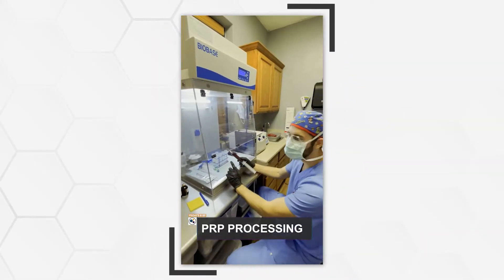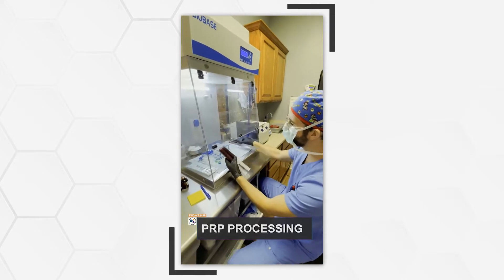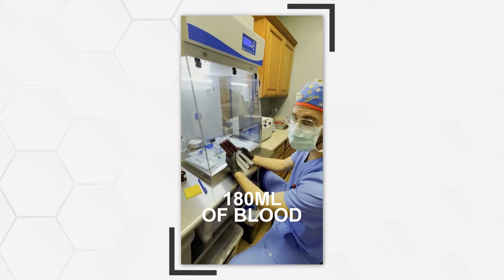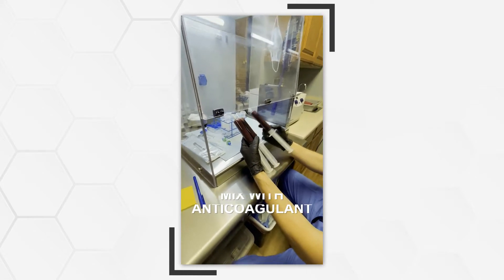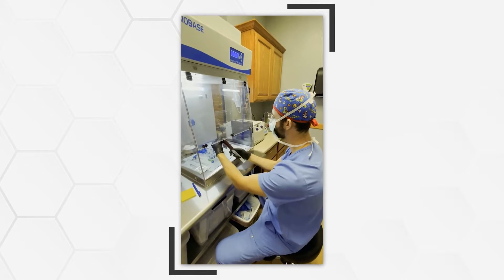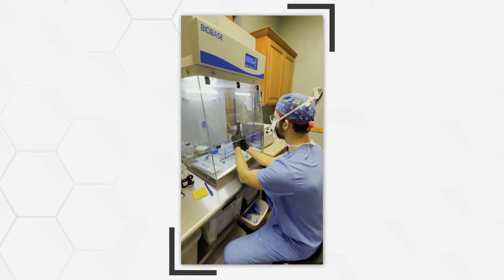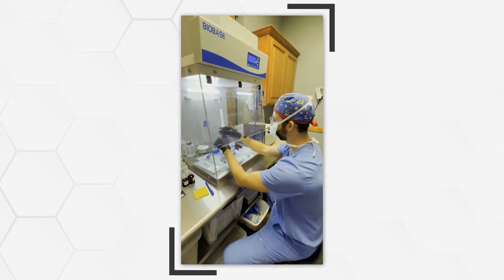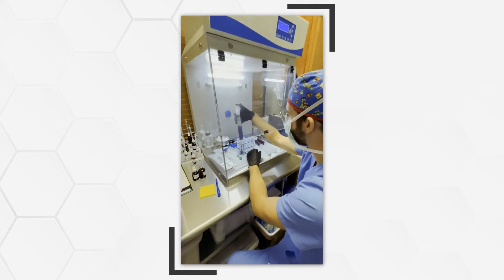All right. So first stage for our PRP blood draw. We drew whole blood from the patient — 180 milliliters mixed with an anticoagulant to stop the blood from clotting too early. First step is to clear out the air and then transfer this into our sterile conical tubes so we can start our first spin.